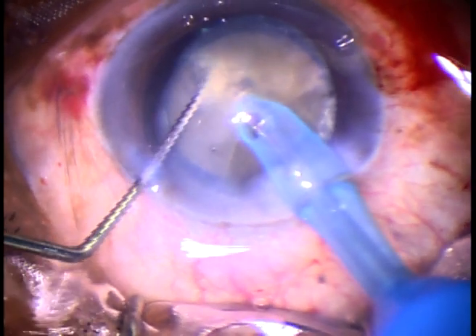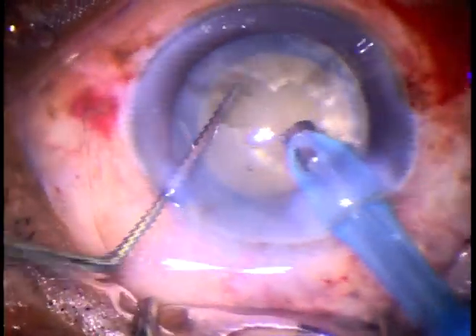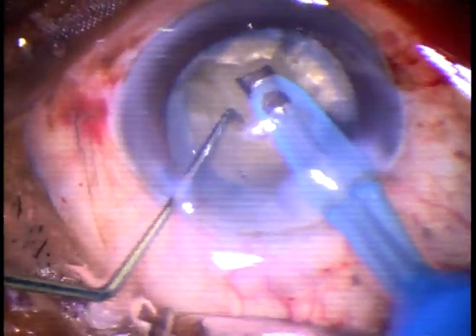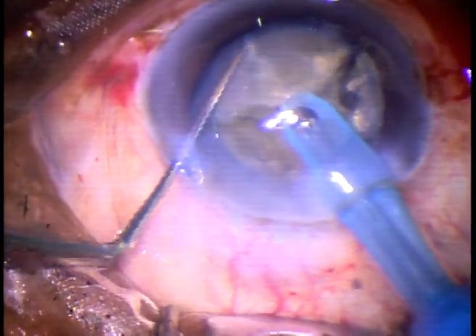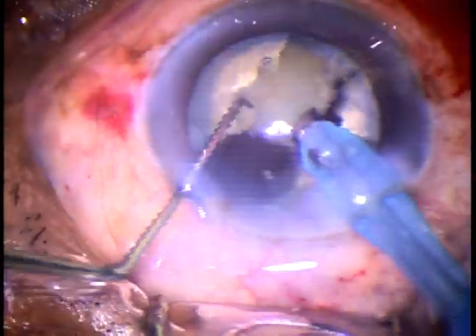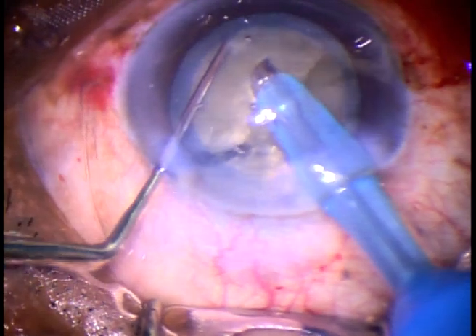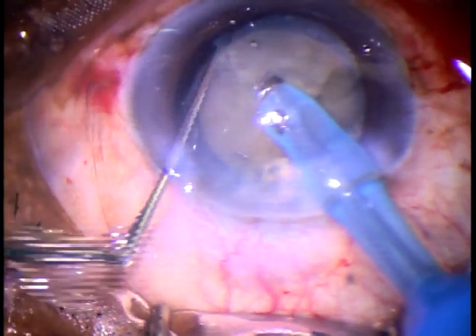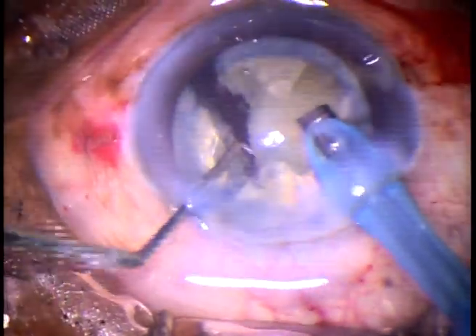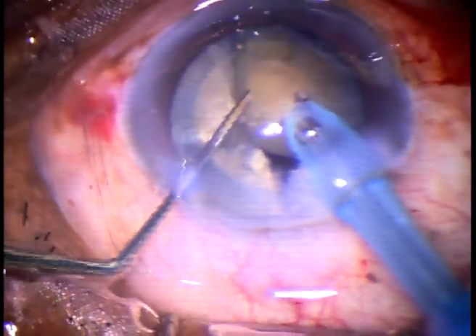This is a very nice idea and anyone can employ this technique in their practice. Though the cataract appears white, the nucleus is quite hard, and all the epinucleus has been incorporated into the nucleus. As I make several chops, we can see the endonucleus — this disc-shaped object is the endonucleus.